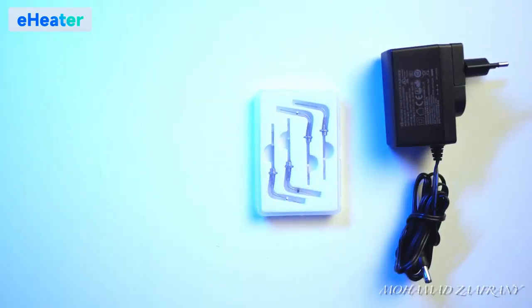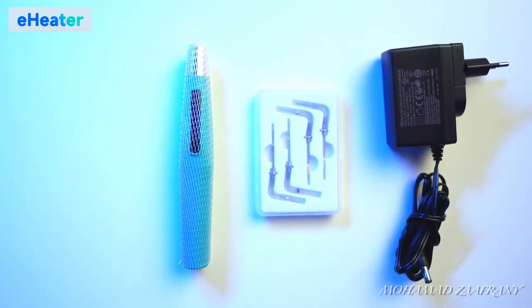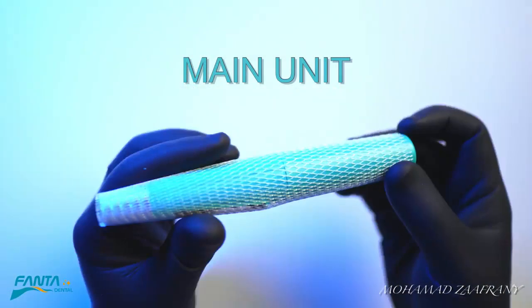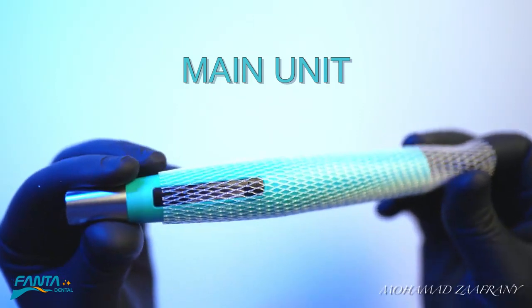Hello everyone, this is Mohammed Zafrani, and today I'm introducing to you the new E-Heater from Fanta. This is the main unit of the device.